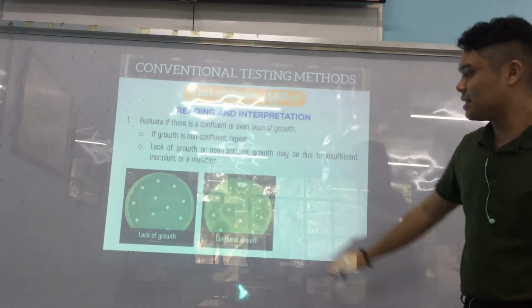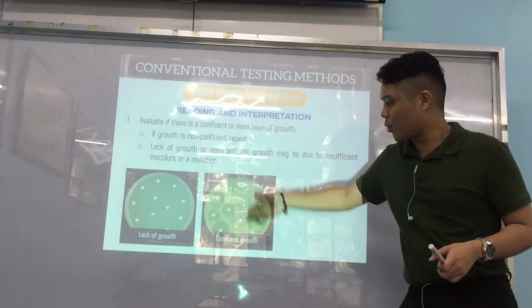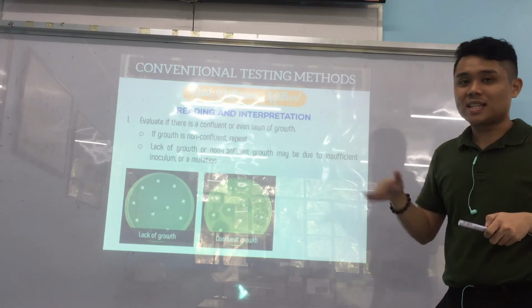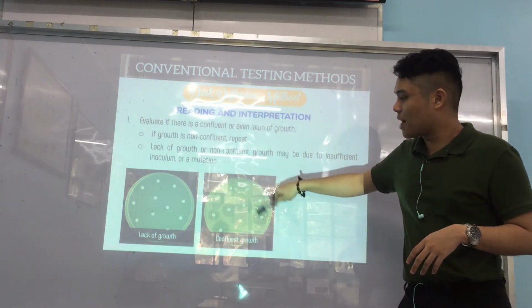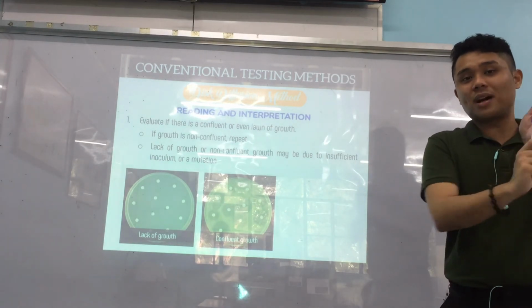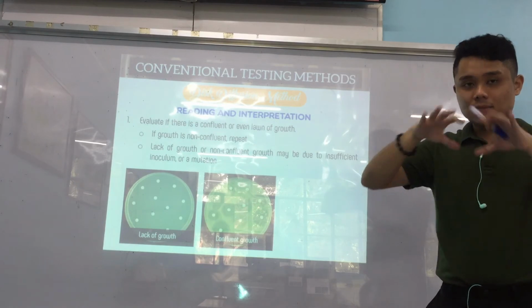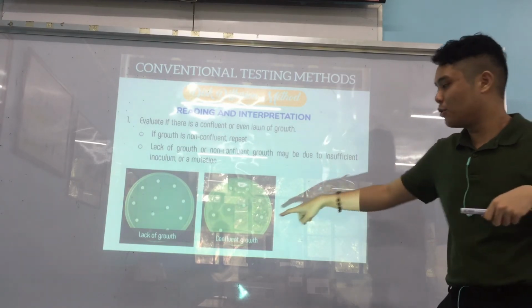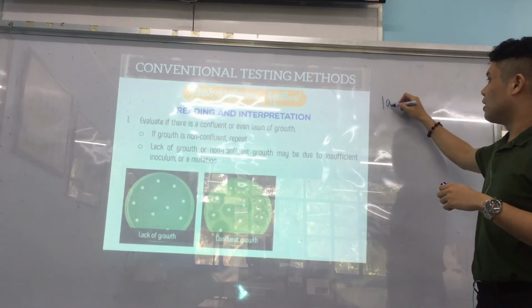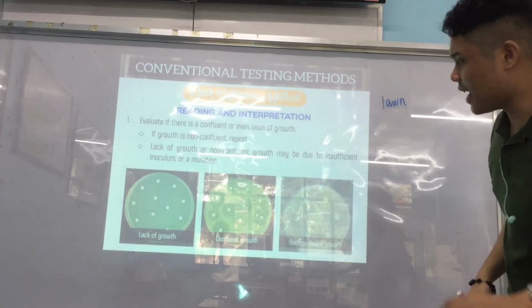Now, your second one is, this is the confluent growth. As you can see, di ba? It's an even lawn of growth. Tanang surface sa imuhang MHA na cover gid sa tanan. Walay murag spaces if naman gani gagmay. Muna siya akong gi-emphasize sa multiple overlap. Dapat dugol inyuhang pag-streak. Okay, because we want to make sure na ma-cover tanan natong surface sa ato ang MHA para makaproduce ta aning confluent growth or lawn as in lawn of growth.